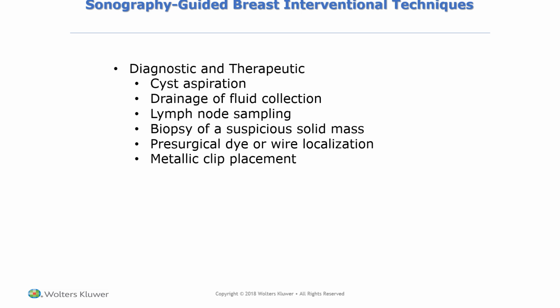visualized on an image when they get into the surgical suite and dye or the wire localization would lead them right to the mass. It also assists in metallic clip placements.